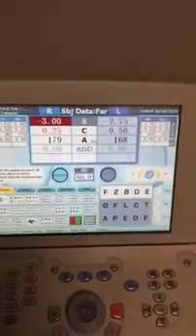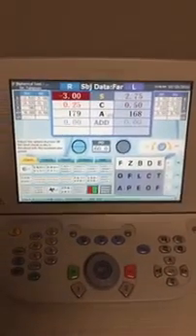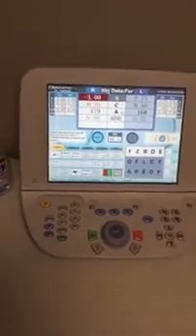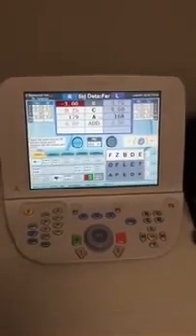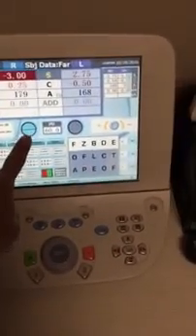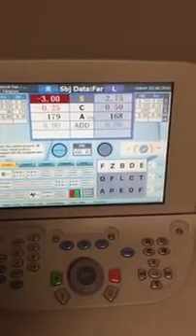But here it is. So in these two big squares right there, that's the AR data, and you can also see them on the sides there where it says AR and the prescription data outside of that. Okay, so when you start the refraction, you are going to start with the right eye. And in this case, as you can see, the right eye is open right here. The left eye is closed, okay?